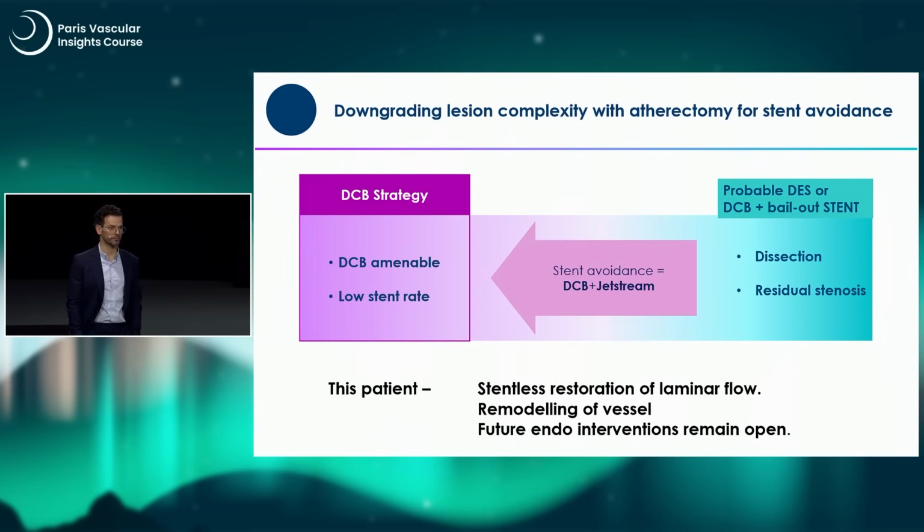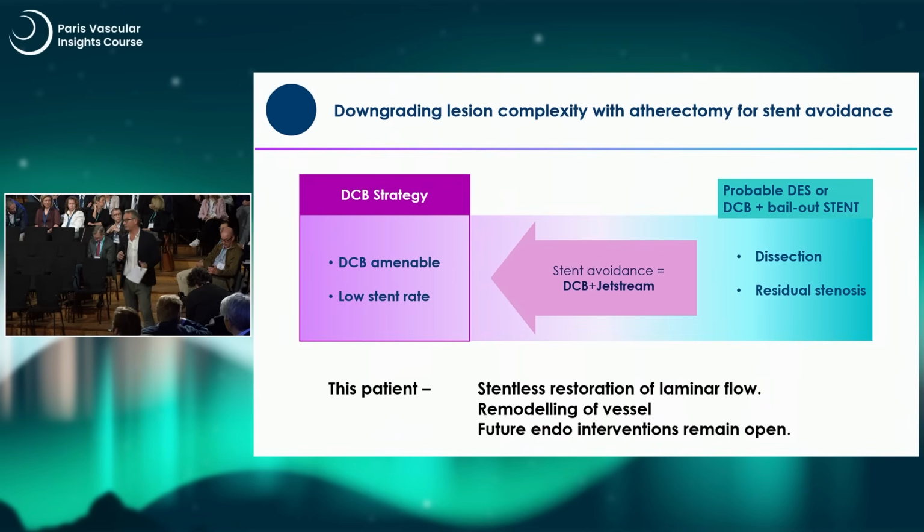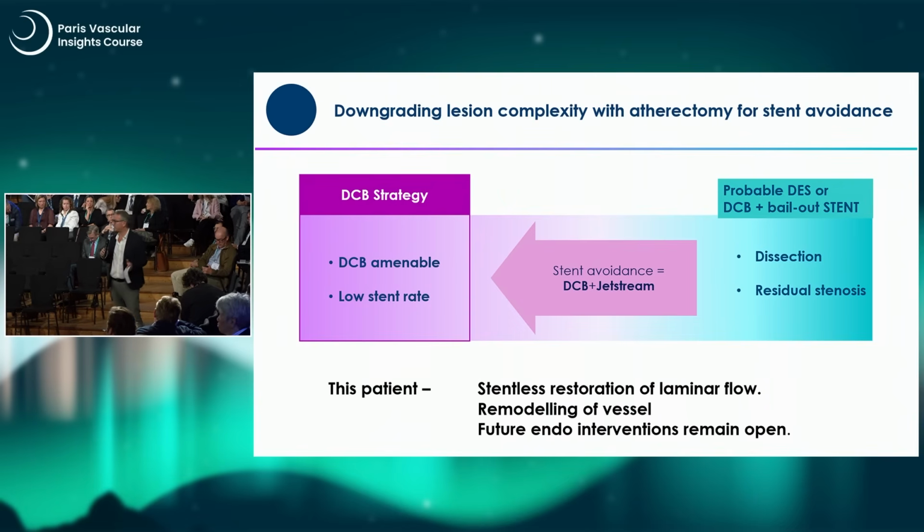Is it necessary to scaffold, to primary scaffold, or to secondary scaffold? We do not have the answer yet in terms of long-term patency. It remains a floating zone.